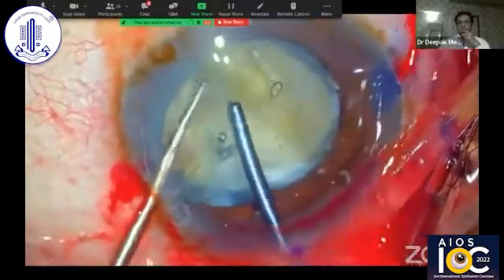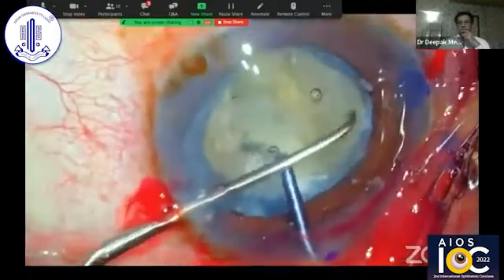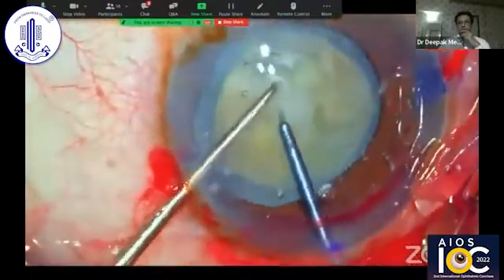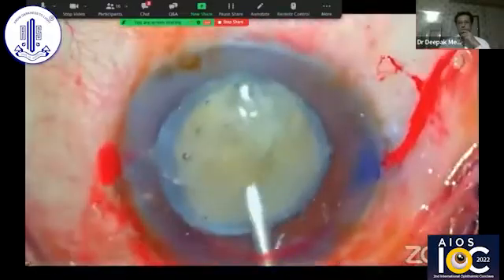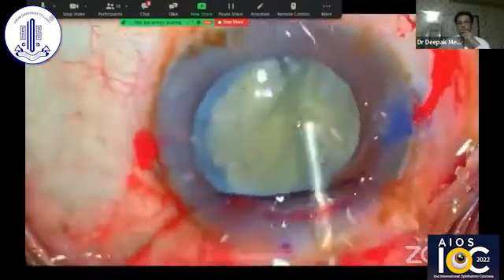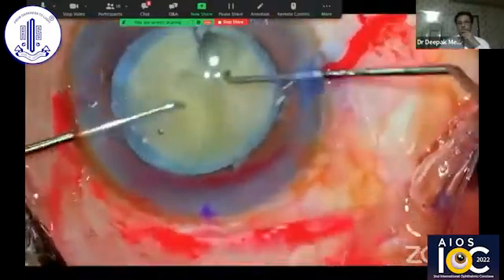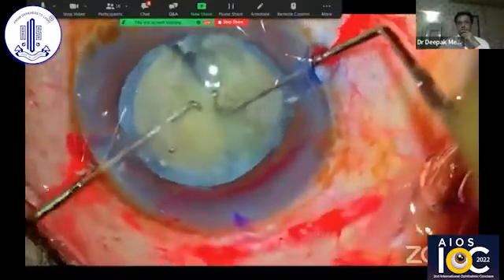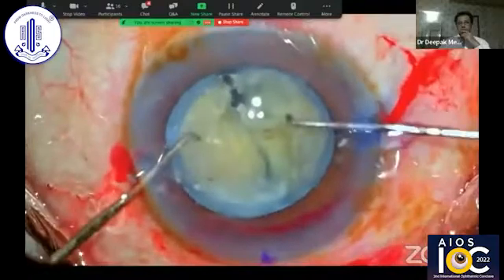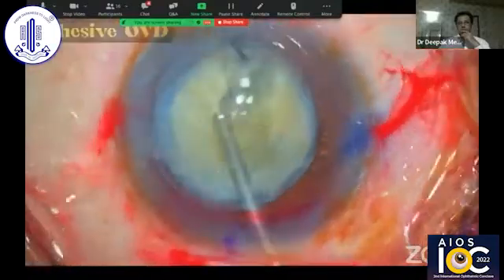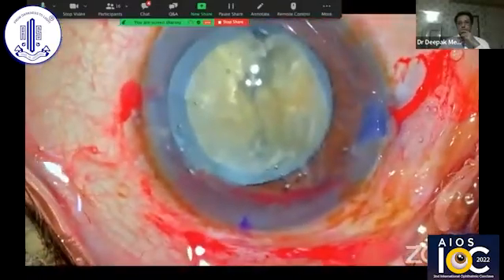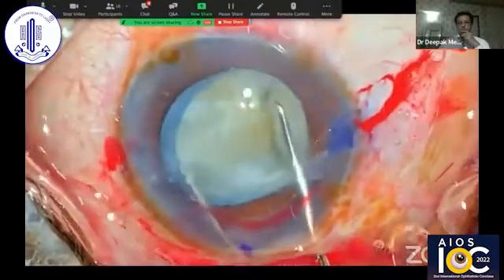The pre-chopper being buried sufficiently deep into the substance of the nucleus may reduce torque slightly. Now assessing the two hemi-nuclei, I suspect the posterior plate is holding on somewhere, so I use viscoelastic to explore and see that the central part of the posterior plate is not totally separated. Using two Sinskey hooks to go into the groove and perform gentle lateral separation maneuvers, I could separate the two hemi-nuclei. Now it is time to prolapse each of them out of the bag into the anterior chamber, and I'm using cohesive OVD to maintain the chamber. With the two Sinskey hooks in the chopstick maneuver, grasping at the two edges of the hemi-nucleus and gently manipulating it out of the bag.